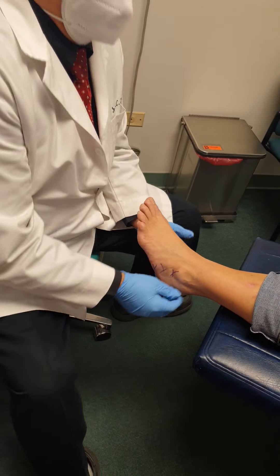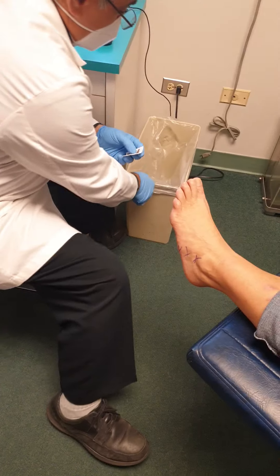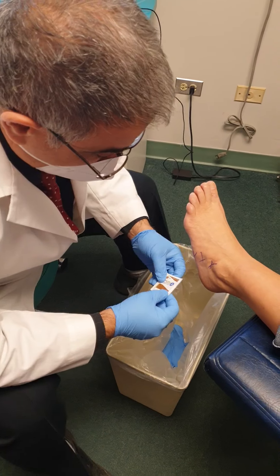Is that okay with you? Yes. Alright, do you want to lie down or stay up? We're going to try and clean it up a little bit.